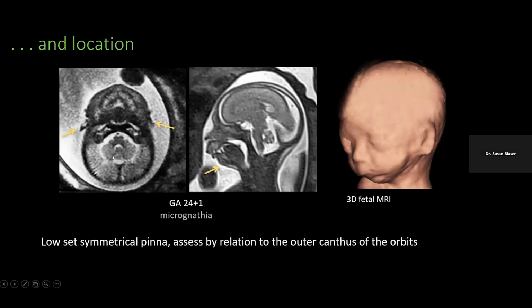I'm showing you images that are a bit grainy because I want you to see that not every image is going to be perfect like the ones we usually show you by choice. So this happens to be a very grainy image that could be due to fetal habitus or maternal habitus. And sometimes we just don't get perfect images. This was done on the 1.5.